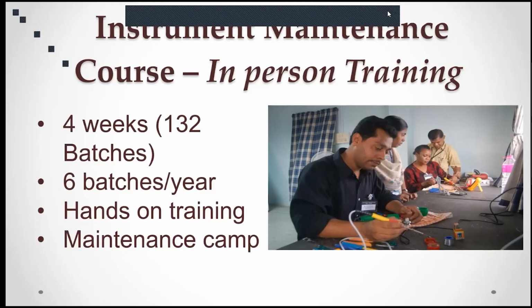We mostly concentrate on hands-on training, and we also expose them to different maintenance camps so that they have some exposure to different types of equipments too. So it's an in-person training program. If you need any hands-on training, then you can come for this program.